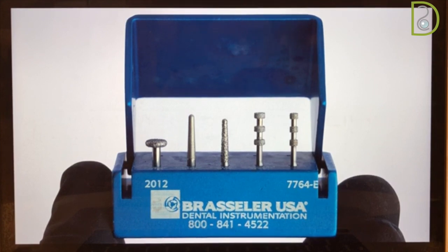Now, what is this going to leave us with? Exposed dentin, so we're going to have a problem with our bonding later on. So why? Because we need our preparation to be on enamel to increase the bonding strength. So yeah, as we said in the beginning, always keep your preparation guided.